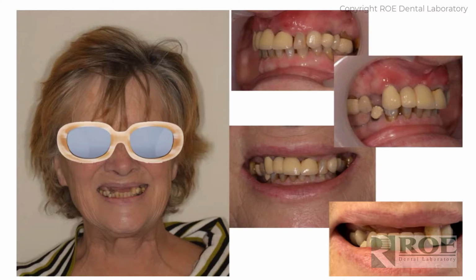So the records, as I mentioned, are typical with Chrome: full face, full smile, left, right, center retracted. We like to have this one retracted. I believe we did get one. And then a relaxed lip posturing as well. So those are the photographs.